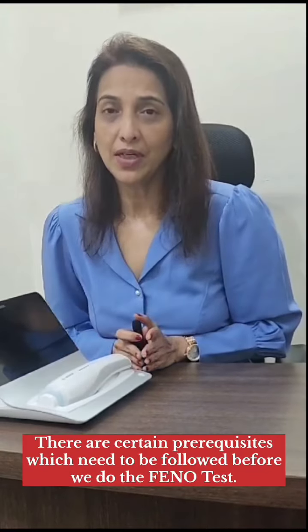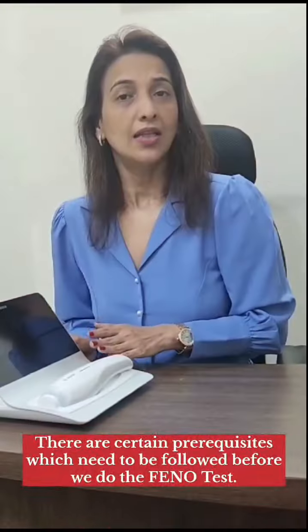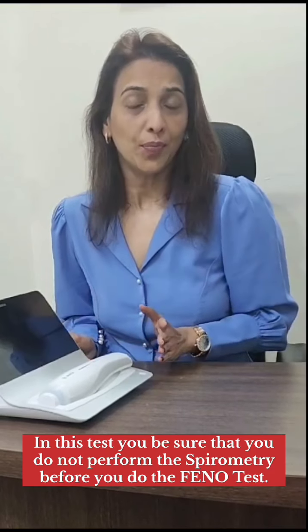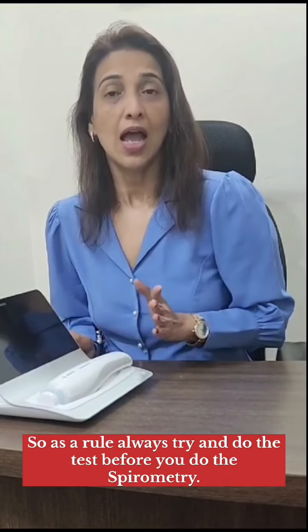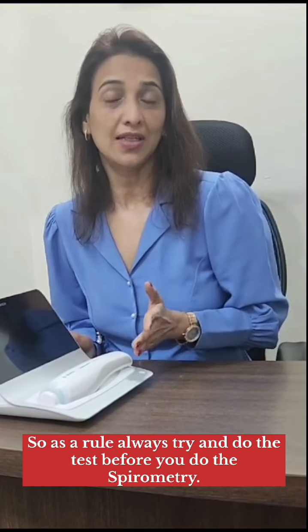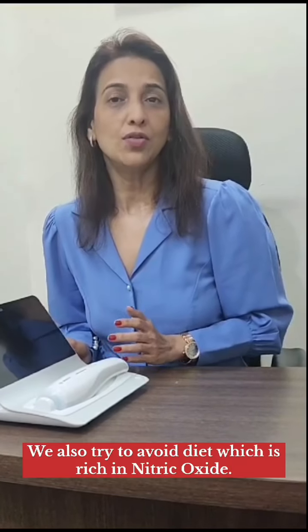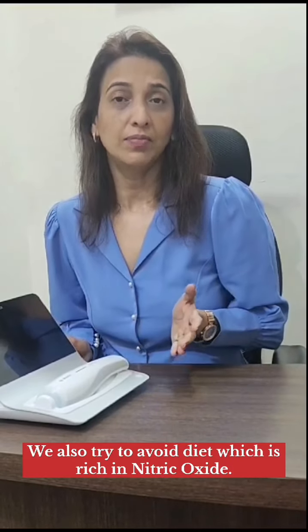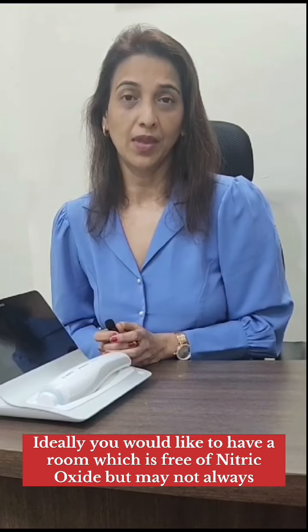There are certain prerequisites which need to be followed before we do the FENO test. Be sure that you do not perform spirometry before you do the FENO test. So, as a rule, always try and do the test before you do the spirometry. We also try to avoid a diet which is rich in nitric oxide. Ideally, we would like to have a room which is free of nitric oxide, but that may not always be possible.